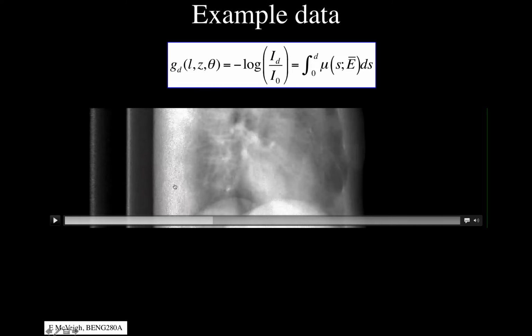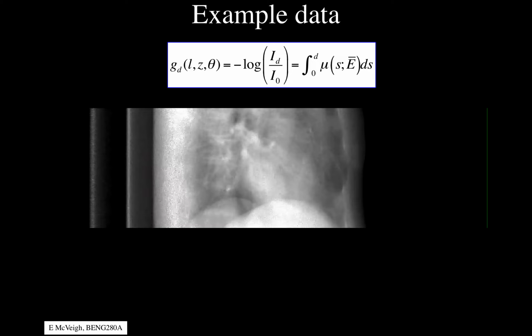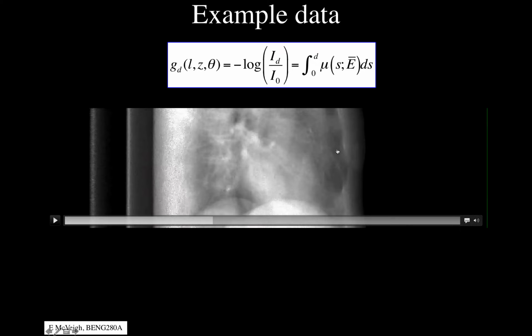The reason there's uncertainty there is we're looking at the patient from their right arm through to their left arm. So it's the longest travel along that beam, and the most X-ray attenuation is going to occur along that beam. In fact, it looks like the detectors are starting to run out of X-rays at that point. Whereas up here, it's going through less material, and so you see a clean signal.